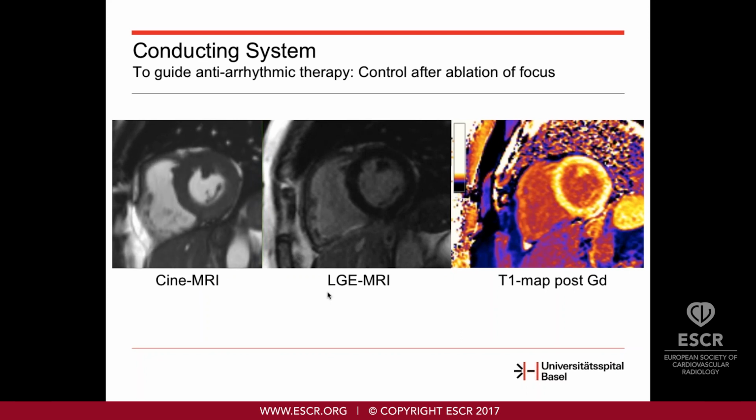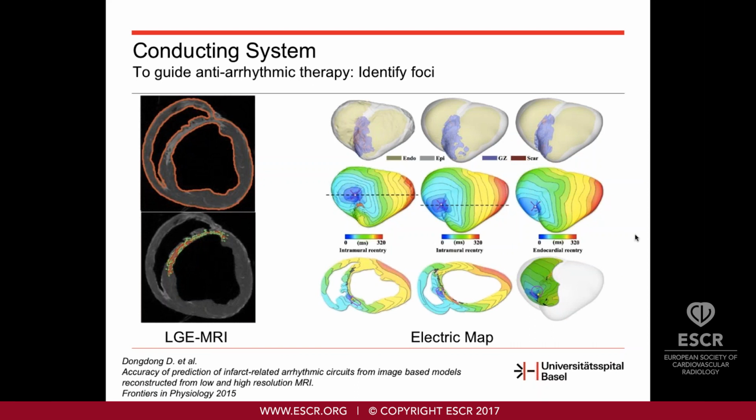So this defibrillator is not an MR-compatible defibrillator, so we had to struggle with two aspects. One is the safety aspect, because, well, it's not an MR-compatible or MR-conditional defibrillator, and also we had to struggle with artifacts. So we took the patient into the scanner, we explained the situation to the patient and that there's an elevated risk to do this scan. We had the electrophysiologist being present during the examination. And so the good news is we didn't have any safety issue during this examination.